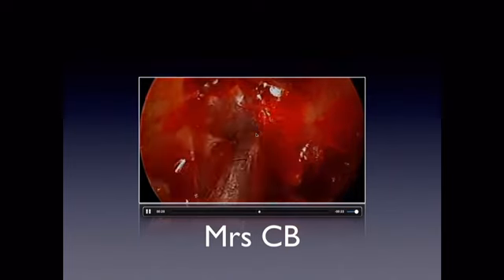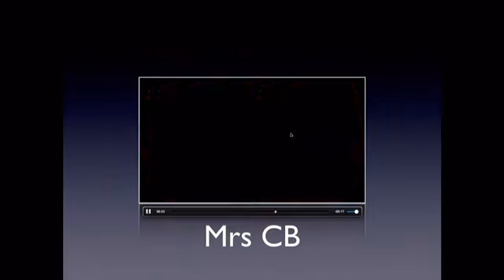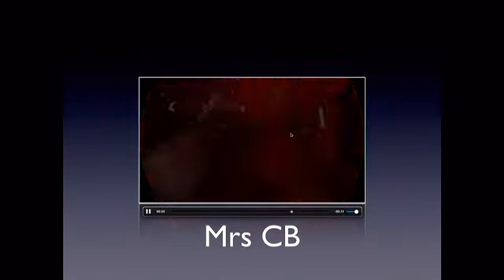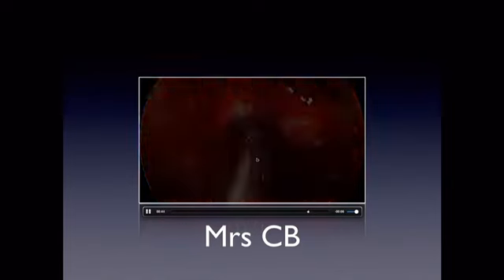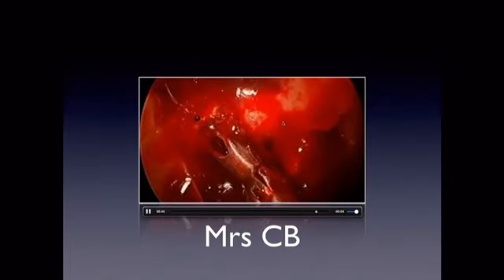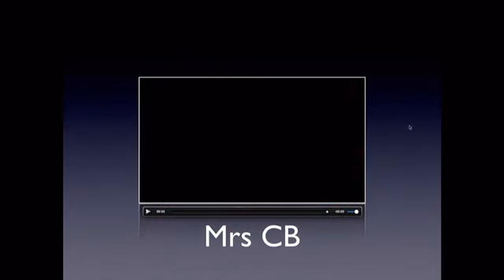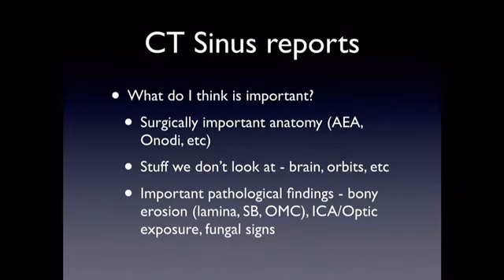And so as we often do with this sort of situation, we buzz the surface of the lesion to try and reduce the bleeding. Incise the lesion itself. This is commonly how we do a pituitary as well. And then take a biopsy. And a bigger biopsy. The first biopsy was a neurosurgeon, the second one was me. So we got that back, and it was a diffuse large B-cell lymphoma. So she started treatment. She's got no other disease. Hopefully she's going to get resolution of her ophthalmoplegia.